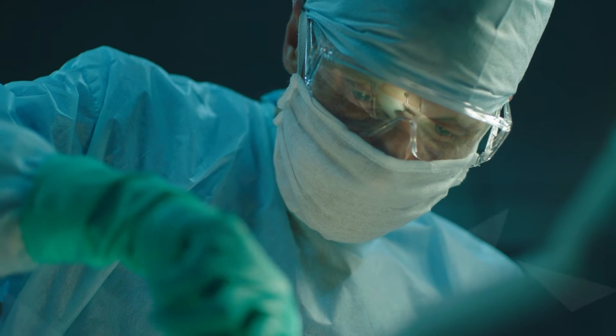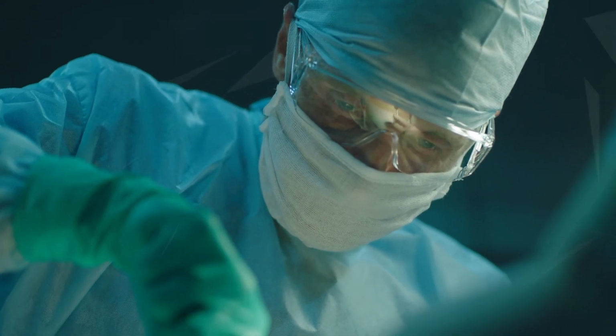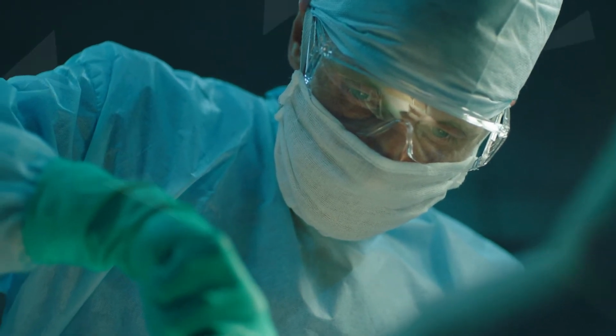With the fixation, often we're looking at what's happening during surgery. The component is typically held in with acrylic bone cement, and we will simulate that surgery either on cadaveric specimens or on polymer sawbones, and then we'll look at what the end component or construct is like, so the full assembly.